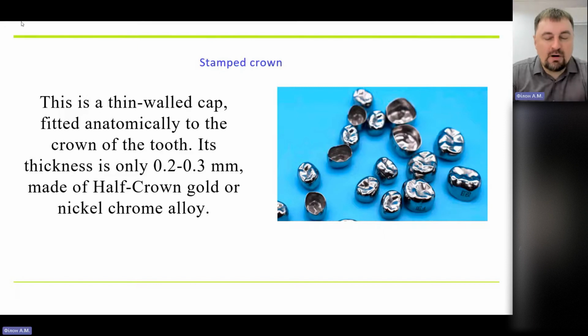And I want to say more about the bad things about the crowns. Look at the form of it. It's in the picture here. Actually, it is a very nice form. Usually, such crowns look very horrible, because they do not have the anatomical form that a crown should have. They're just simple.